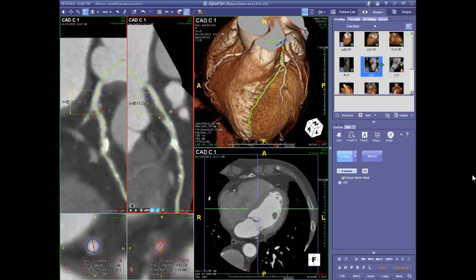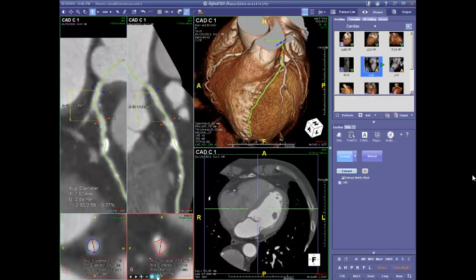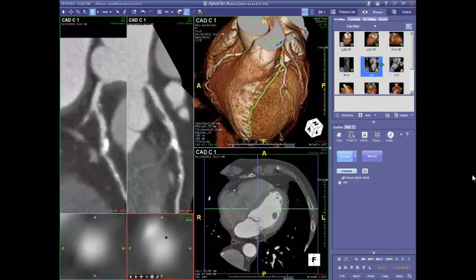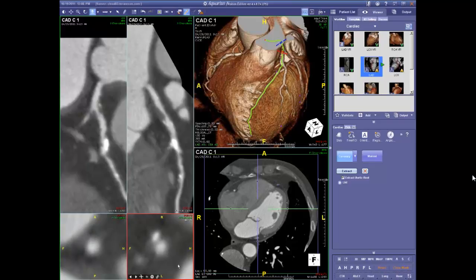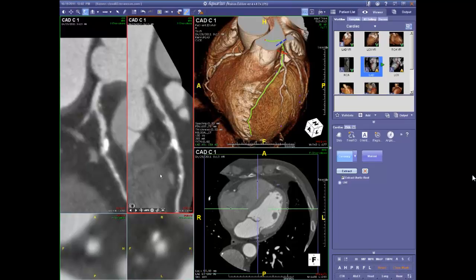Let me move the cross-section down into the area where we might have had some hemorrhage. Taking the mask off - it's a little hard to represent. Hounsfield unit-wise, here we're at 700-800, so we probably have calcium here as well as contrast. In another area, Hounsfield units are 600-700. The actual density of the contrast-enhanced blood was greater than usual, but I think we probably have both calcification here and some contrast dissecting back up into the vessel. It's a little bit hard to make proof of that by just looking at the cross-sectional images.